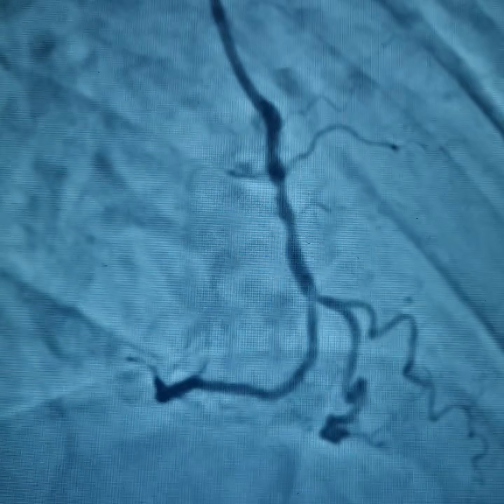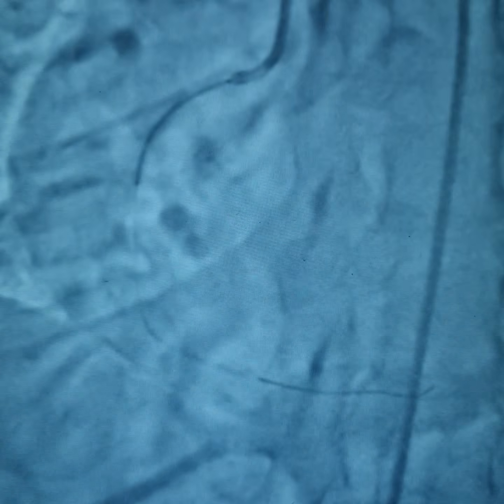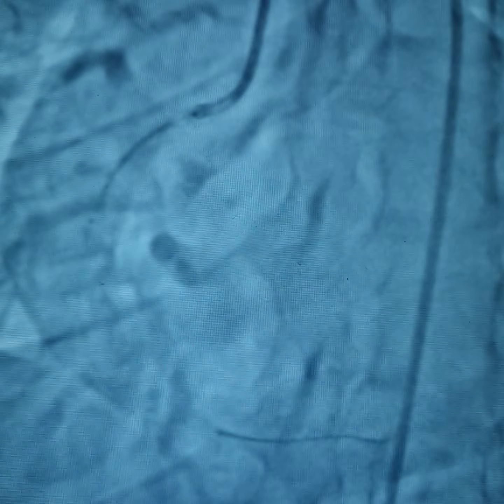So we're taking a long stent in the proximal part of the RCA, replacing the stent in the ostioproximal region, and I think the stent is being expanded well. And yes, see the stent expansion is being done. Some post dilatation in action.